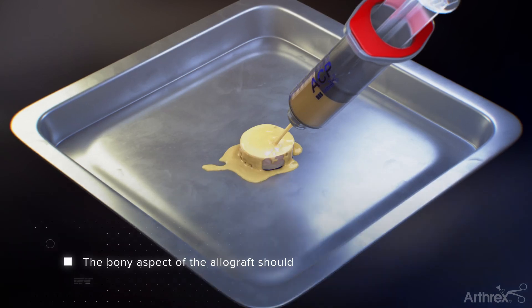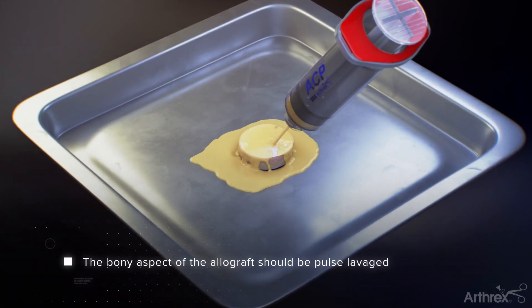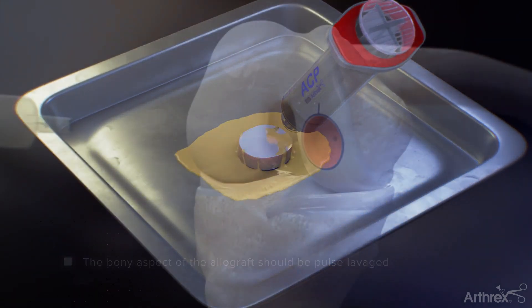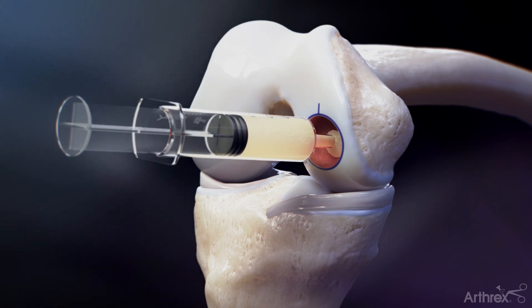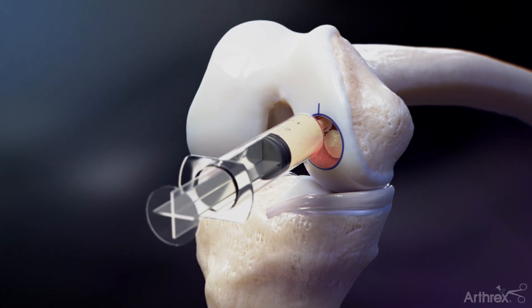The allograft bone may be soaked in autologous conditioned plasma prior to implantation. A thin layer of demineralized bone matrix, DBM, may be applied to the recipient socket to make slight adjustments as needed.